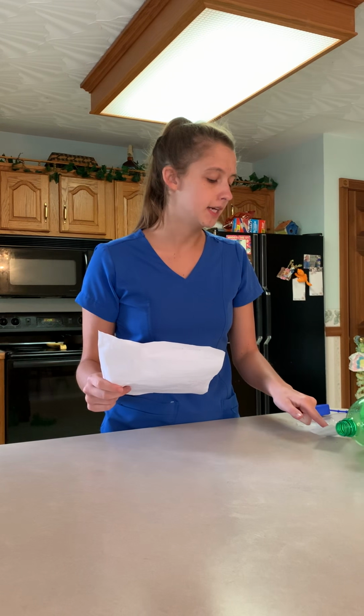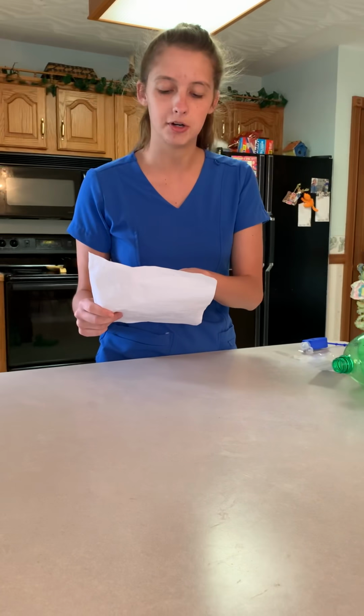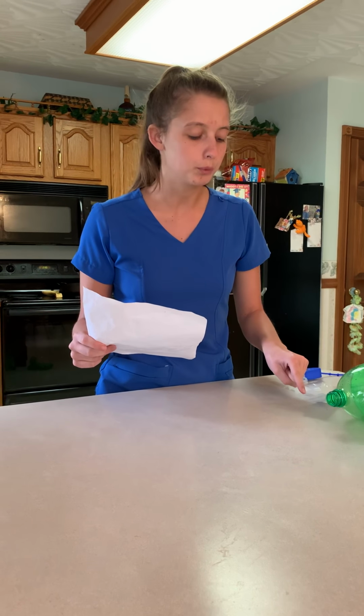Okay, so what I'm going to do first is verify the patient's ID band against the healthcare provider order. On the patient's ID band, the patient's name says Ren Harami, and on the healthcare provider order, the patient's name says Ren Harami. On the ID band, his date of birth says 3/3/83, and on the order, the date of birth says 3/3/83. On the ID band, the patient's ID number is 160-01-1180, and on the order, the patient's ID number is 160-01-1180. So they all match up, so therefore it's okay to proceed.